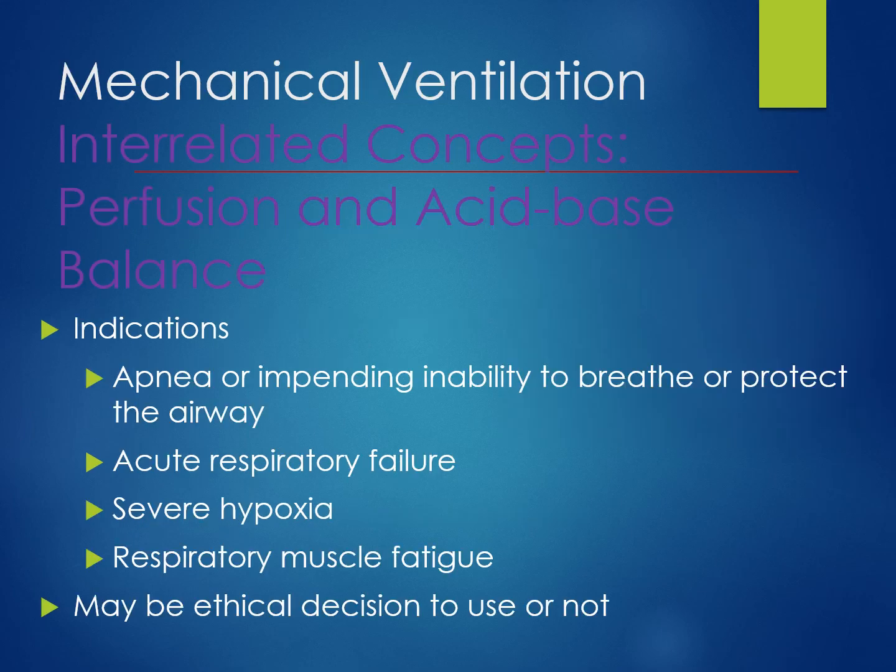Okay, so moving on to mechanical ventilation. Typically patients are intubated and put right onto a mechanical ventilator once placement is confirmed. Our indications are apnea or impending inability to breathe, like a respiratory code situation, acute respiratory failure, severe hypoxia, or respiratory muscle fatigue.